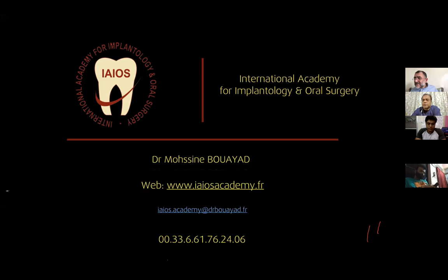First you try to place an IPRF kind of thing, or the CGF first, so that it seals the Schneiderian membrane, and then you place the graft, or you just prefer placing the CGF and get a tenting effect by placing an implant. Because as you go by Boozer et al. and most of the people all around the world, they say that the minimum length of an implant should be 10 millimeters. A shorter implant is not ideal for them.